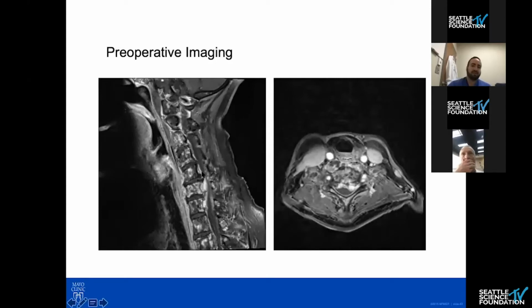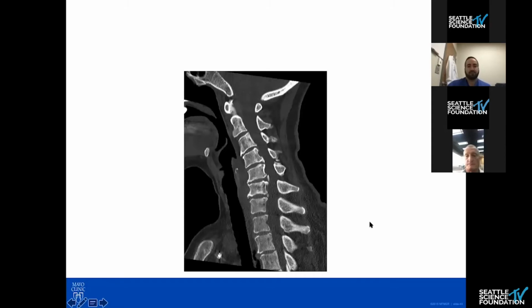epidural disease, most compressive behind the C6 vertebral body. There's also a degenerative osteophyte there. And this cut is through C6 where there's spinal cord compression. So looking at her imaging, not a significant amount of lysis, not a significant amount of posterior element involvement. The majority of the compression is here behind the C6 vertebral body, despite some degenerative changes.